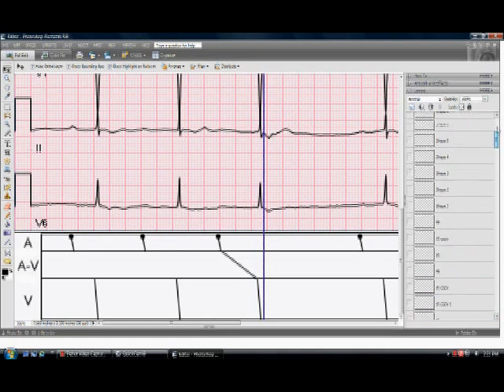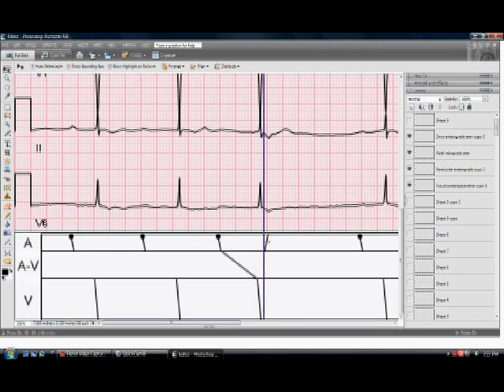And again, I will add in an oblique line which is showing retrograde conduction. It's right up against the plumb line, lines it perfectly with that retrograde P-wave in lead two.